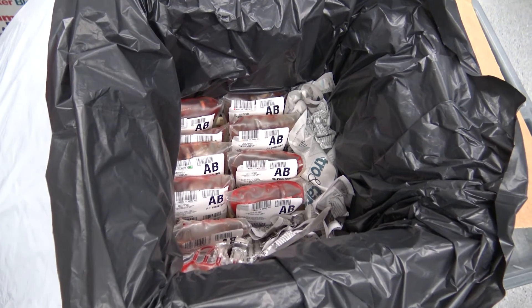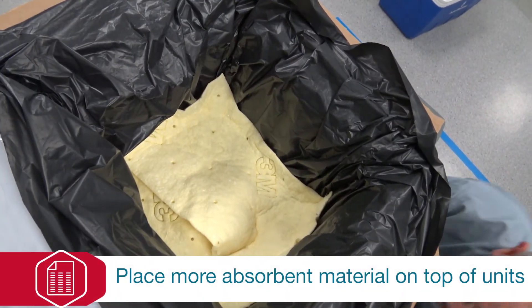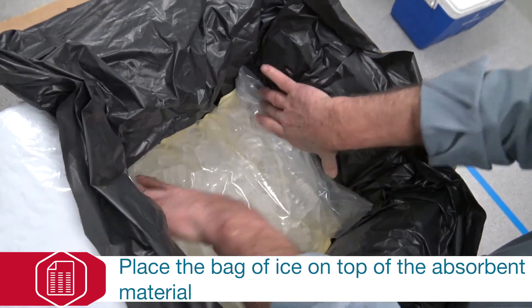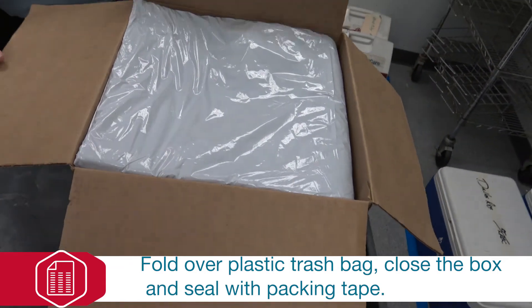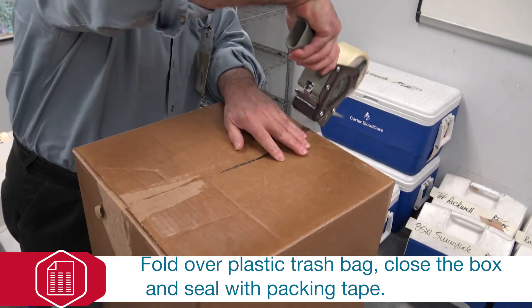After the units are packed, place more absorbent material above the packed units. Then place the bagged wet ice on the absorbent material over the units. Close the insulation and the top and sides of the shipping box and seal with packing tape or duct tape.